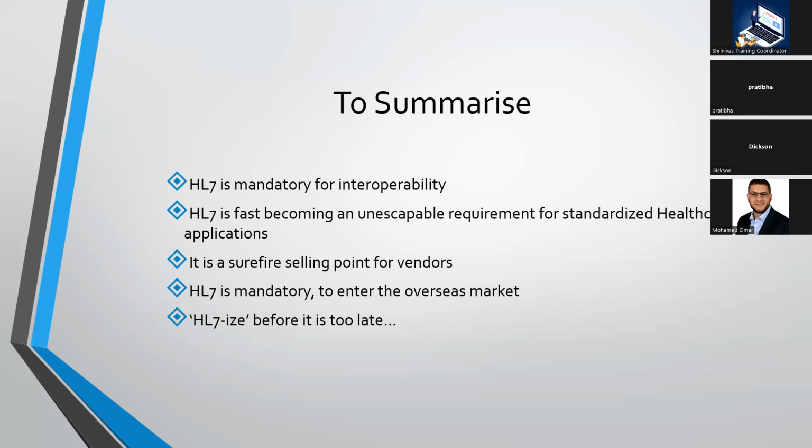Not only with me, but also with other healthcare trainers out there, no one would be able to give that to you. Is it very much different from Mirth Connect, or quite similar to this tool? The process would be pretty much the same. I have worked on Rhapsody as well, but how you build and execute the interfaces is different. The architecture of how Rhapsody works is different, but it is not rocket science. If you understand the integration world, it's not a big deal to understand Rhapsody. You just have to get familiarized with the application.